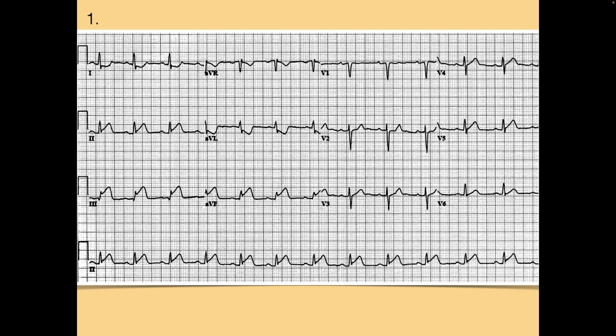One thing you can always do and should do is serial 12 leads. You can get reasonable 12 leads as you're going down the road. Do a 12 lead on scene, and as Riley said, we're loading and going. Leave the V lead electrodes on, replug them in when you get in the back, and then it's easy. You just keep pushing the button, and it spits out another one.